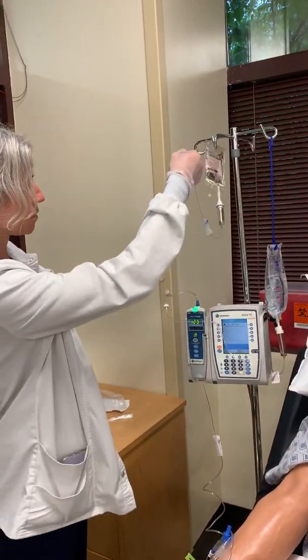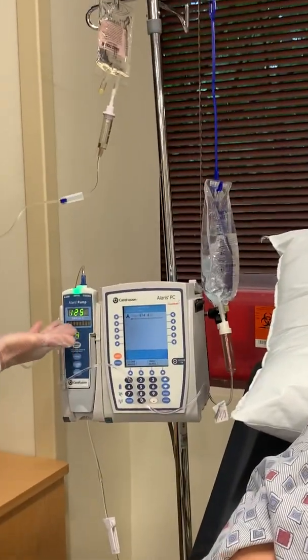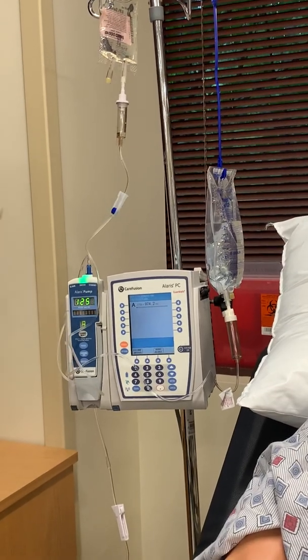Okay. See how that goes. I've got my secondary up higher than my primary, okay? What is running right now? We're at 125, so we're still running our primary, okay? So it's time for us to come in and set up our secondary.